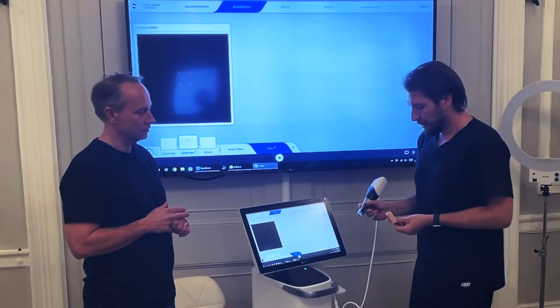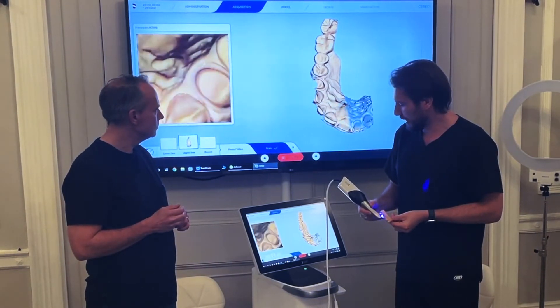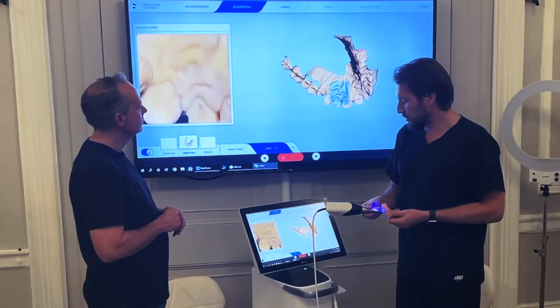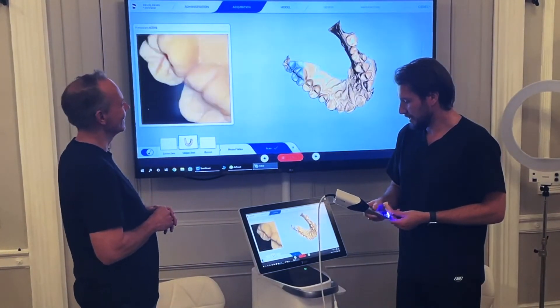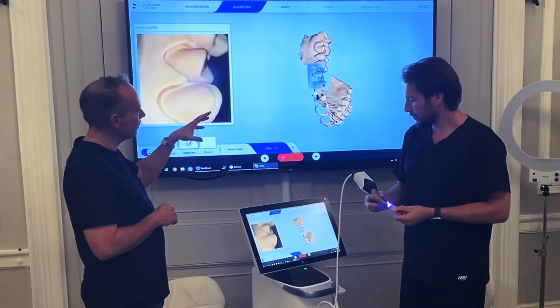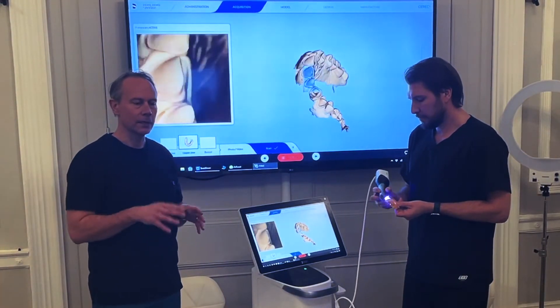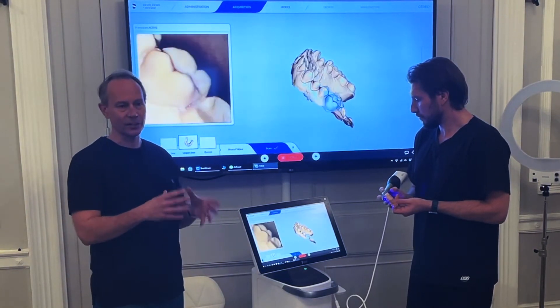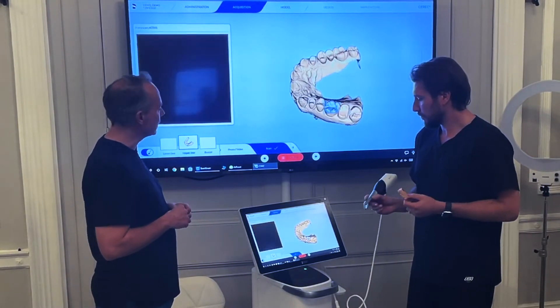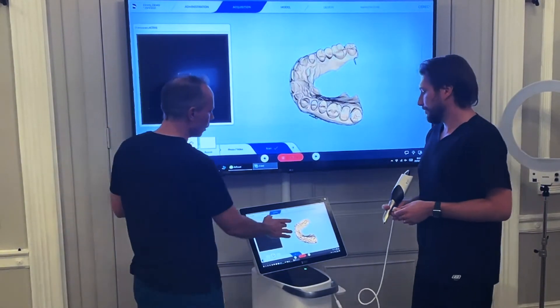We're going to scan the palatal side, and one thing — I would not look at the patient while doing the scan. Look at the screen, because if you look at the patient you'll lose where you are. You can see the camera has a really nice depth of field; even held away from the teeth it still picks them up. This is remarkable for things like a root canal or implant crown where you can actually see the connection and hex inside it.